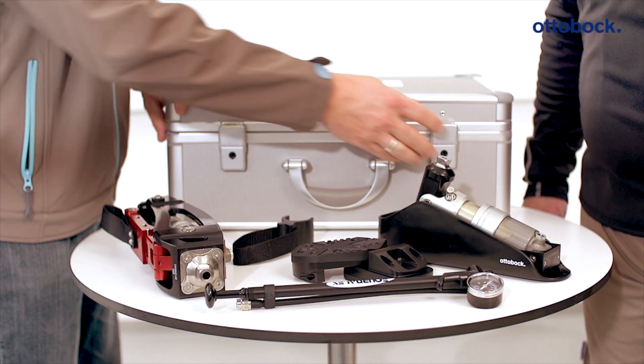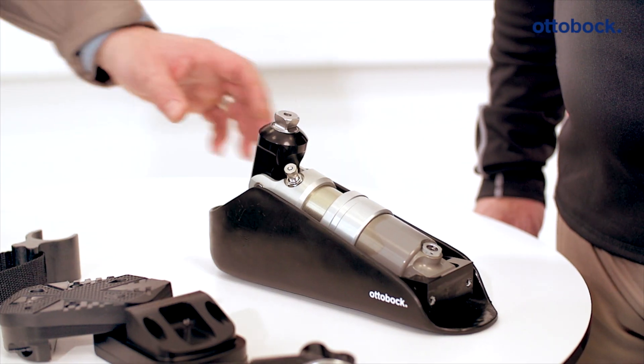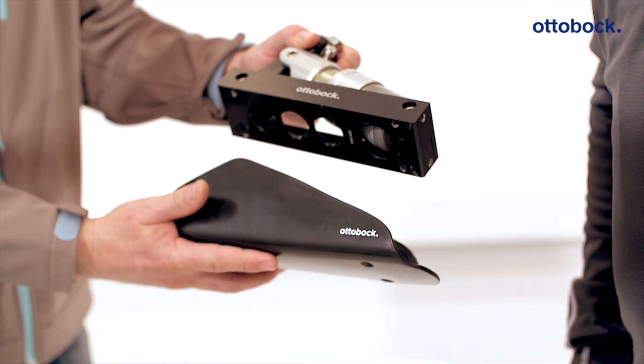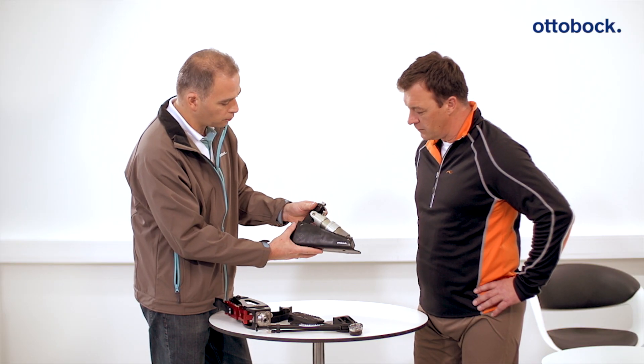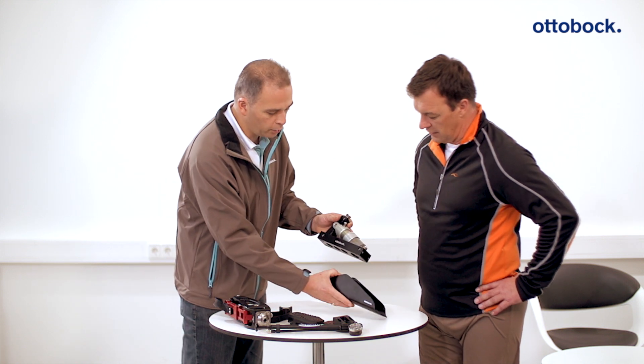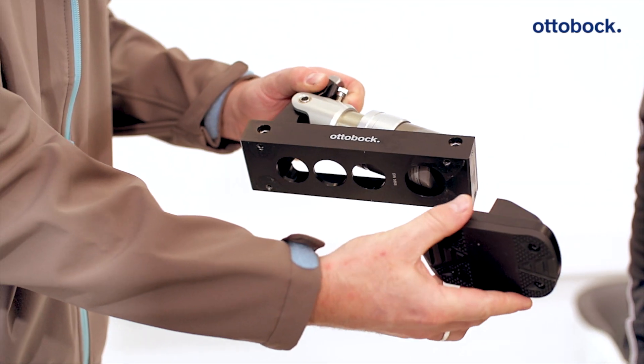The Pro-Carve prosthesis is individually adjusted during the trial fitting, during which all parameters are adjusted according to the requirements and abilities of the user. The foot component can be equipped either with a foot shell particularly suited to snowboard boots, or with screw-on pads that make it possible to step directly into the ski bindings without a ski boot.